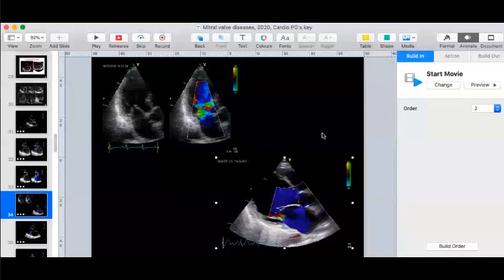So please remember, secondary, that you can have a posterior jet when there is an involvement of the posterior wall. You can see that this is an akinetic, almost severely hypokinetic posterior wall. So what happens here is that there is tethering of the posterior mitral leaflet. This leaflet gets pulled, and because of that there is a gap generally at the P3 point, and that is why you get a posteriorly directed jet.